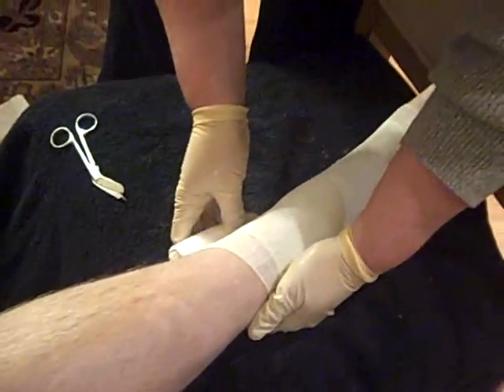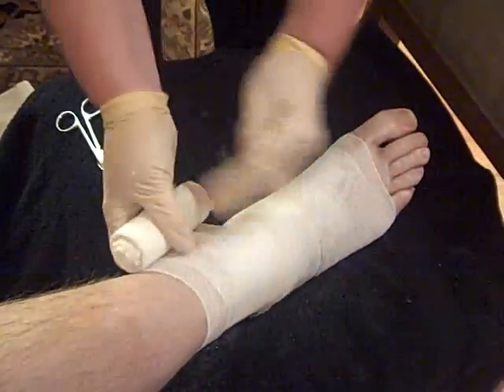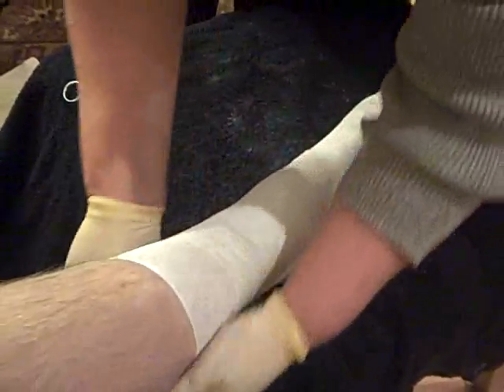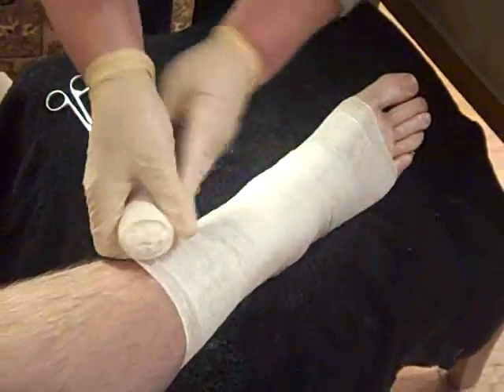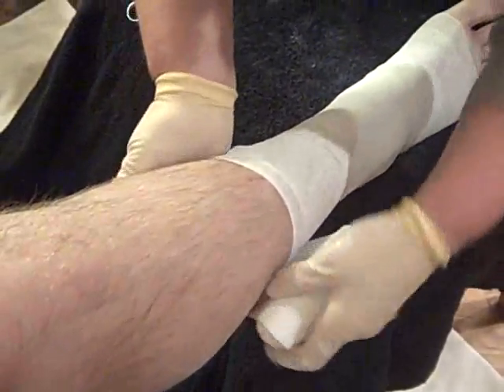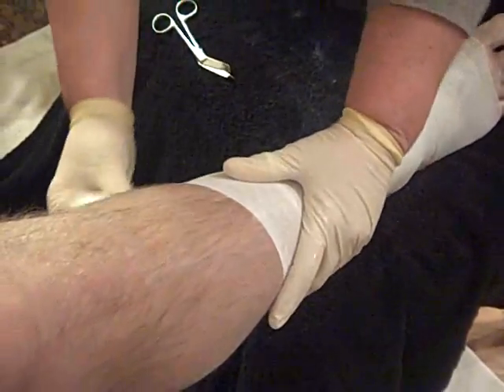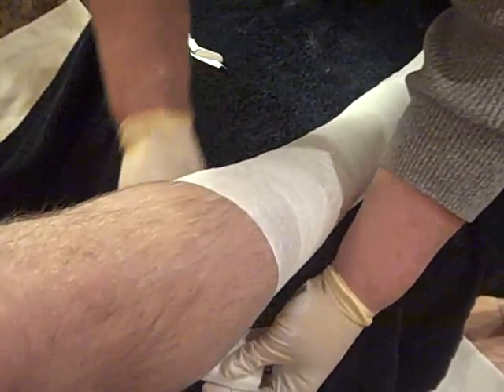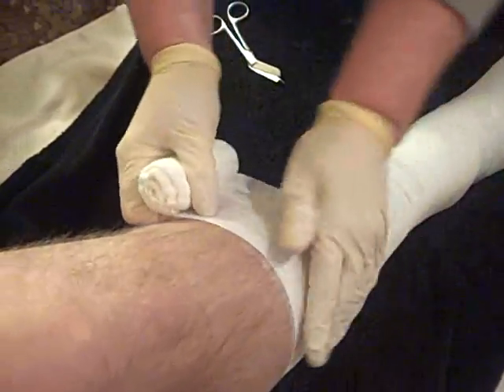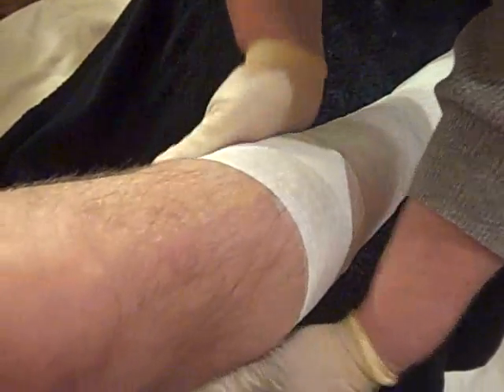So it's very important that you make sure that you have no wrinkles. You're going to continue up the extremity, making sure that you have no wrinkles. You don't want to apply with any kind of tension. How does this feel to the patient? It feels soft, a little cool because of the ointment, and soothing.